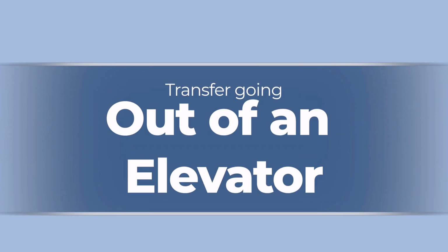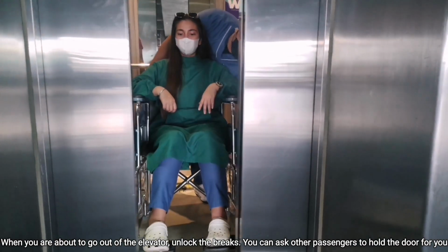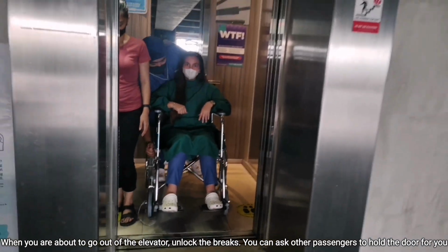Transfer going out of an elevator. When you are about to go out of the elevator, unlock the brakes. You can ask other passengers to hold the door for you.